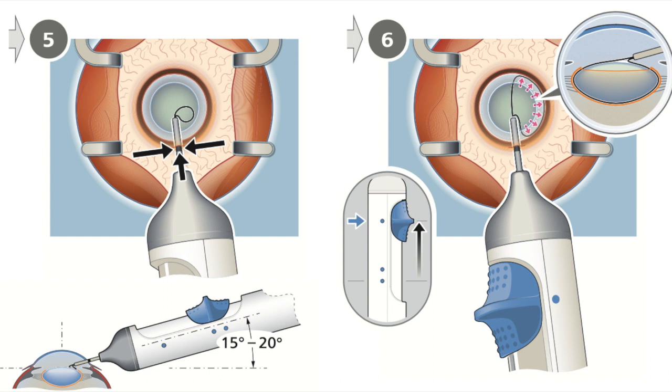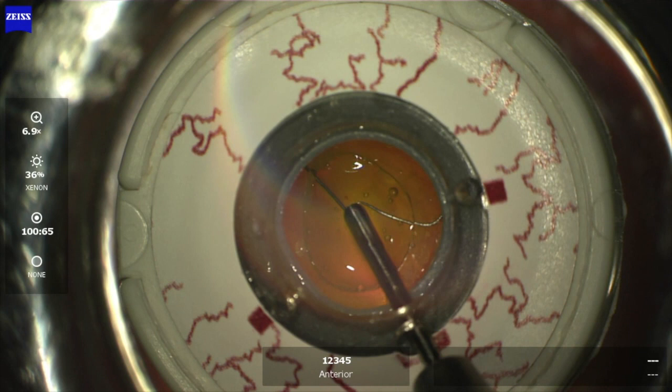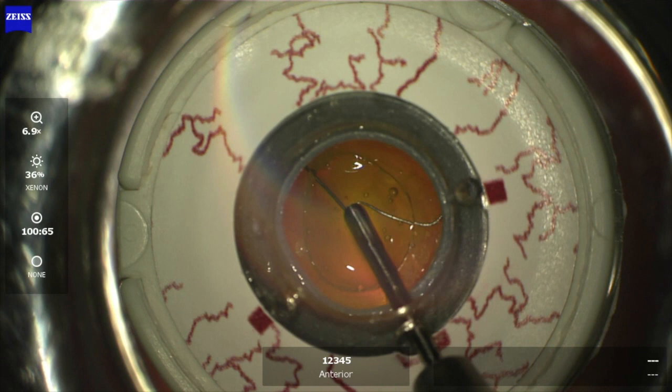Next, you'll see the other common mistake with alignment. In this video, I am too far into the eye. The black band should be outside the limbus, which will situate the tip of the cannula shy of pupillary center. The loop isn't circumnavigating the lens in the hydrodissection plane. I am on top of the lens and end up displacing the lens after a great deal of resistance, wondering when the loop will come back posterior.